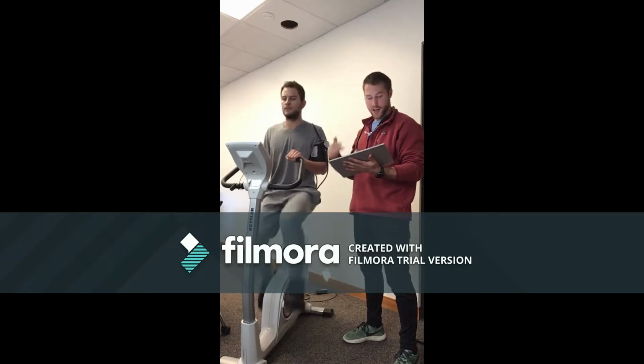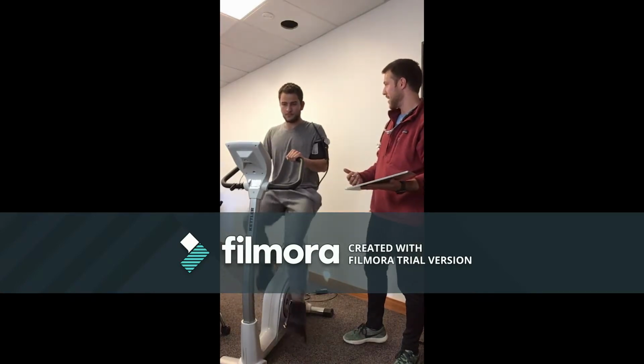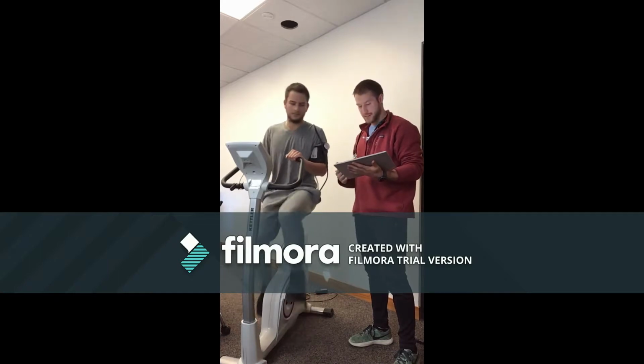And if your diastolic blood pressure is ever greater than 110 or it goes up or down 10 as well, that would be another indication that we would want to stop. Okay. Makes sense to you? Yes. Sounds good? Still feeling all right?